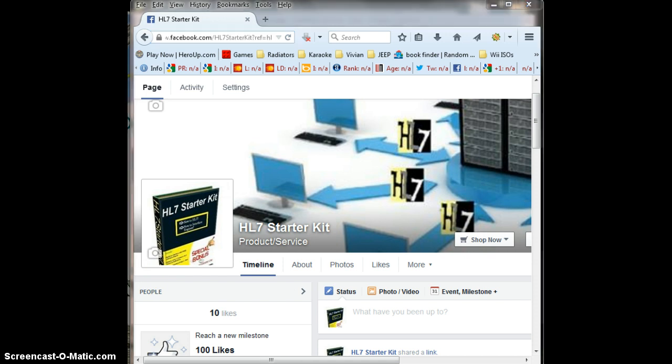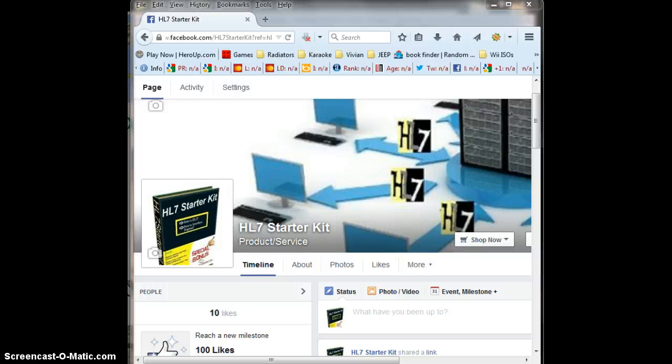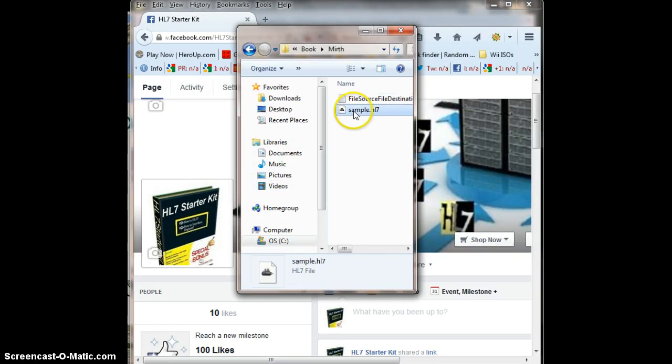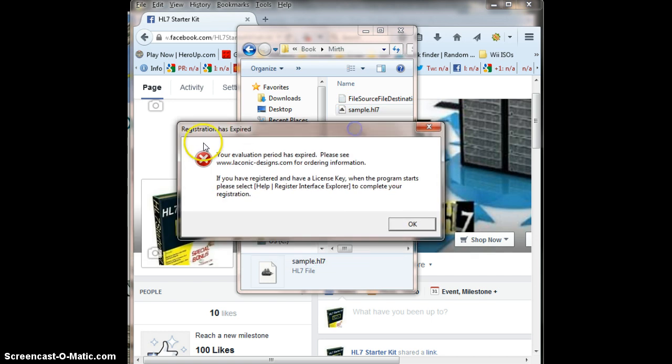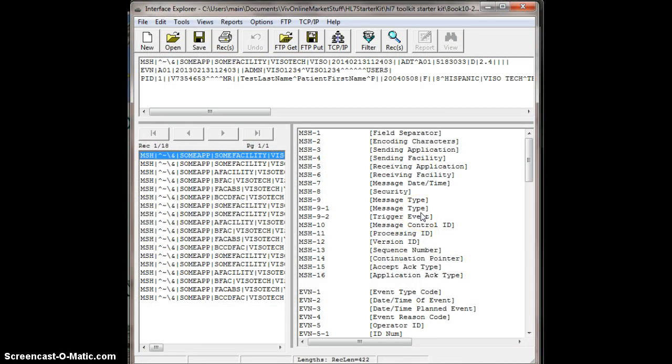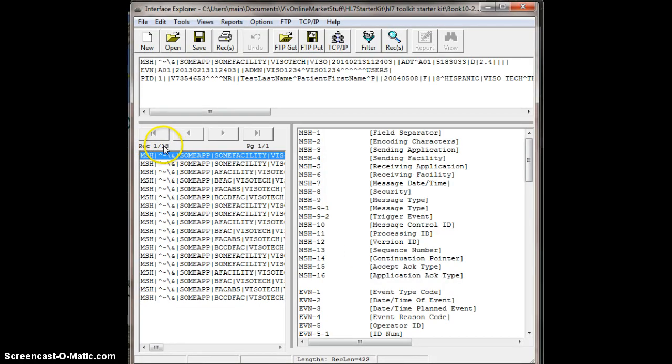The first one I have here is you can open HL7 files with Interface Explorer directly. By default, Interface Explorer will open up any .HL7 files, so let's go ahead and do that and show you how to do that. Here's a sample .HL7 file, I'm going to double-click it. Here's the registration expired pop-up, and I just click OK, and Interface Explorer nicely opens up my sample .HL7 file, which happens to have 18 messages. I can open up a .HL7 file.